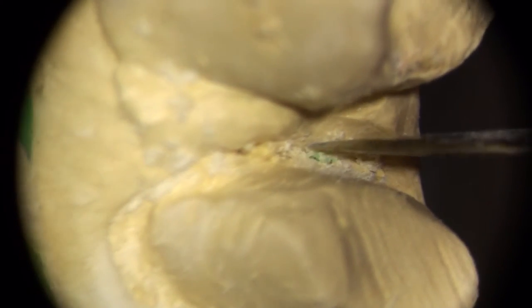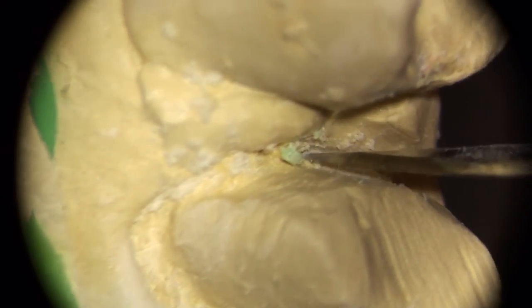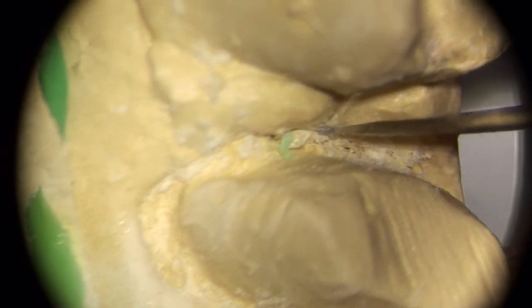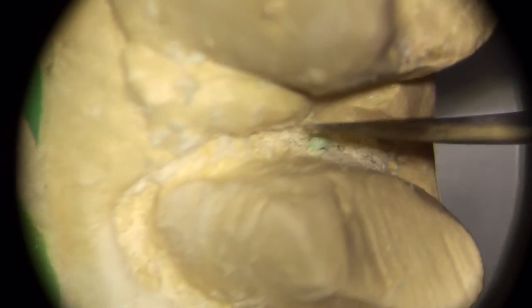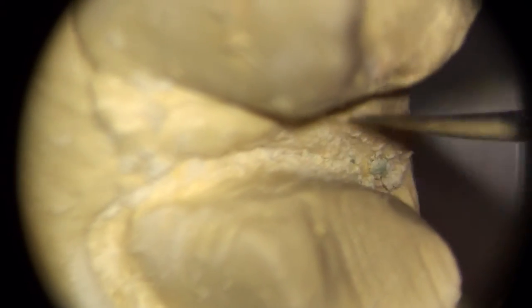This is a case where if you can scan this in the mouth, it's much easier because when you're doing intraoral scans, gum tissue looks totally different from tooth. At least again on my E4D, it looks very different. It looks darker. So even though it's shooting with a laser, it has just a darker look. It's much easier to tell what's what. So you can just look in there and go, oh, okay, there's tooth, there's gum.